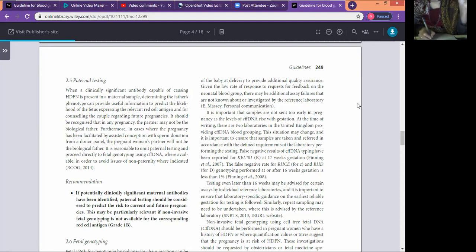We use phosphate buffer saline to dilute the samples in 1:2, 4, 8 and 16 dilutions. We take this test up to the IAT phase, and the results which are positive for a 1+ reaction we then report as the endpoint of our titration method. The reciprocal of the highest dilution is then the reported titer.